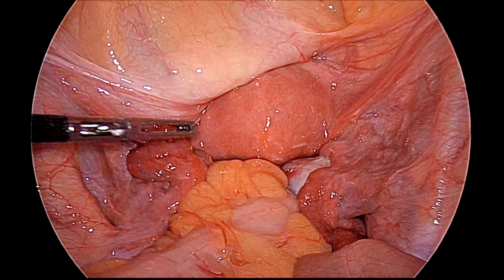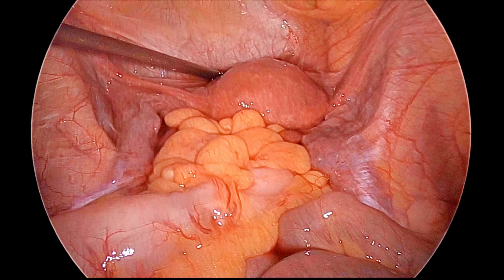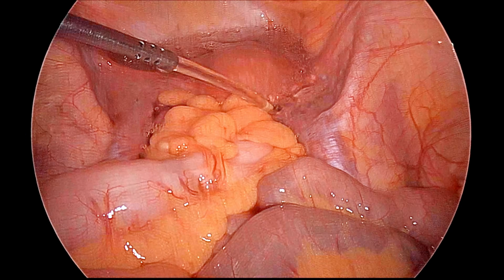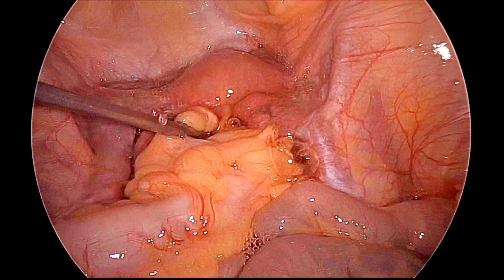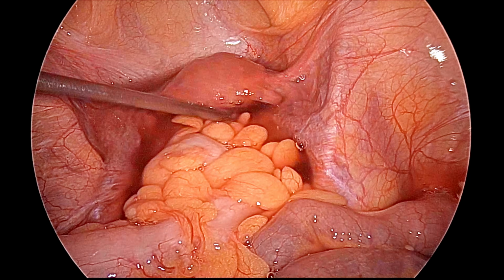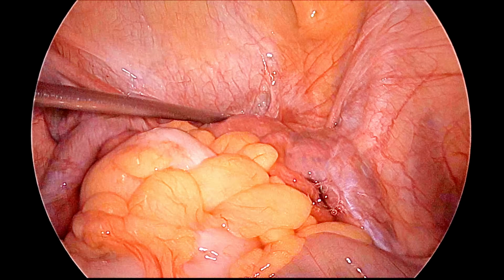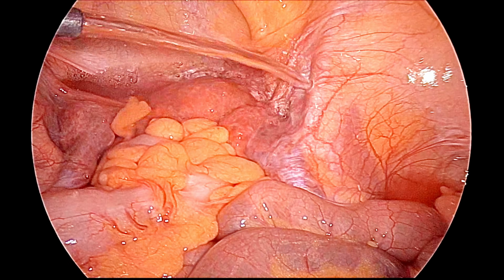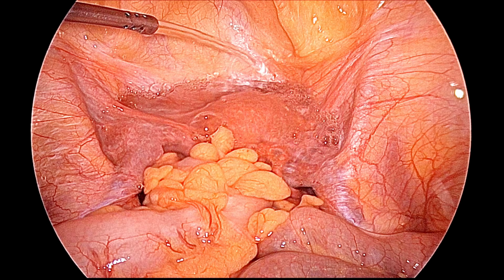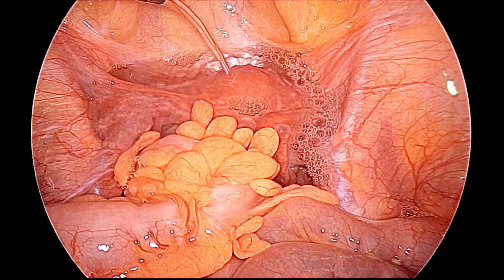Once the diagnostic laparoscopy and this tubal patency test are over, after that what we will do is put some suction and suck out all the extra fluid. During hysteroscopy some extra fluid has also come, that you will suck, and after that you can leave some of the fluid inside, approximately 500 ml to 1 liter. Ringer lactate or normal saline you can leave inside, and you can remove your telescope.